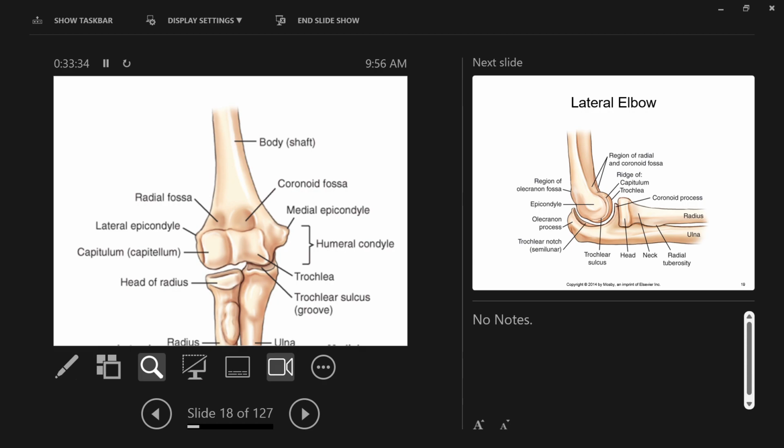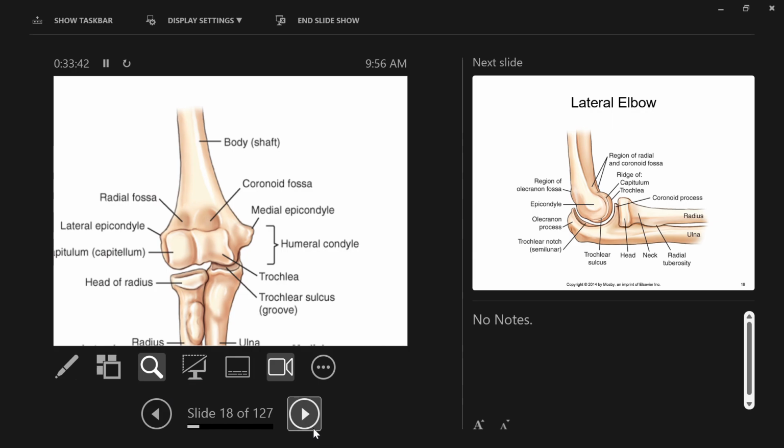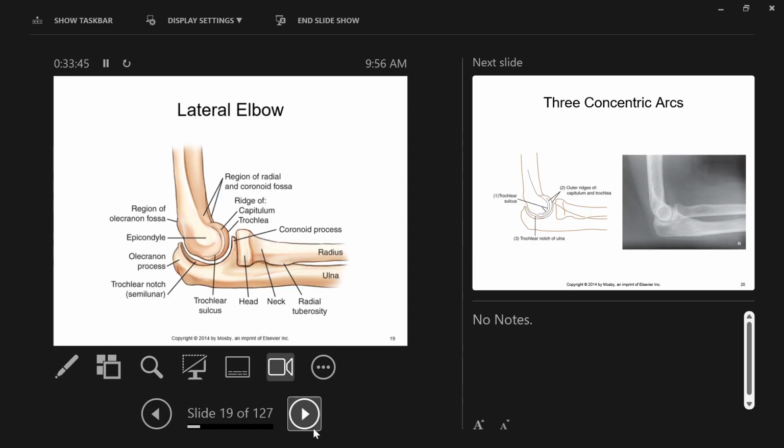All right, interesting stuff happening from the anterior perspective, looking from the front. Lots of interesting things happening from the lateral view as well. Some of the same anatomy, but let's take a walk through this. So now you're seeing this the same as these, or at least close to the same. This is a true lateral view. In the true lateral view, you should see a defined space between the trochlear notch and the trochlea itself, okay?